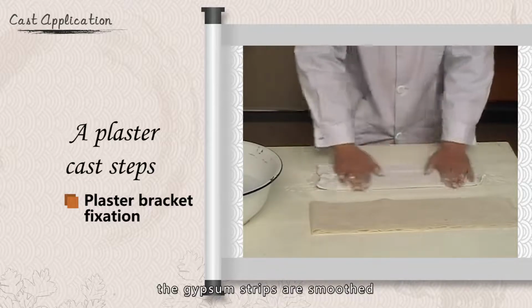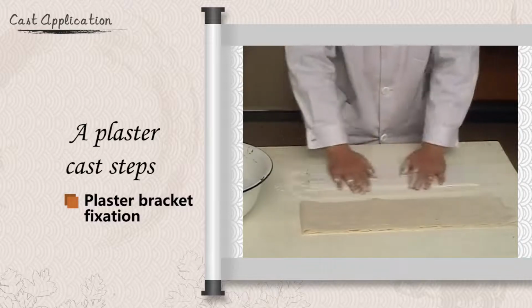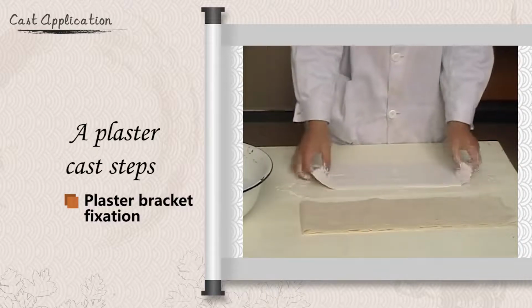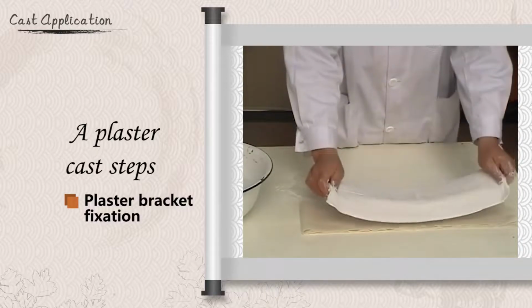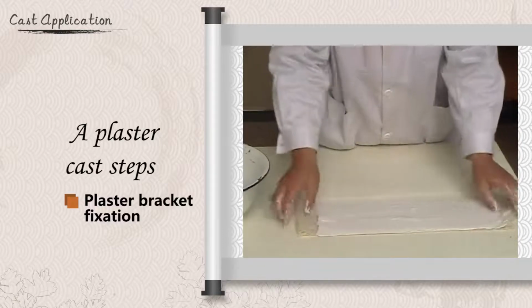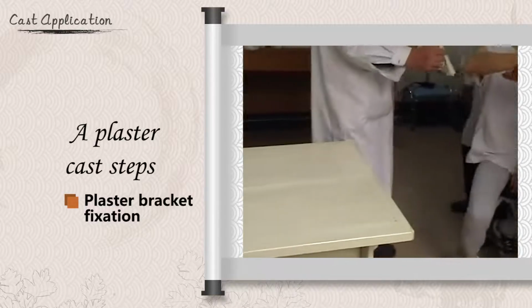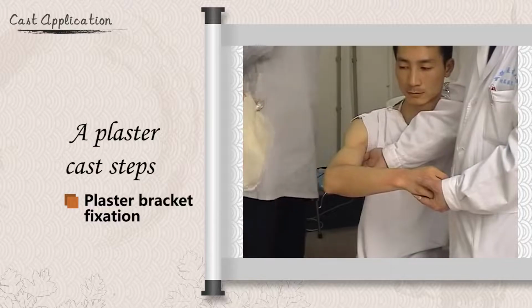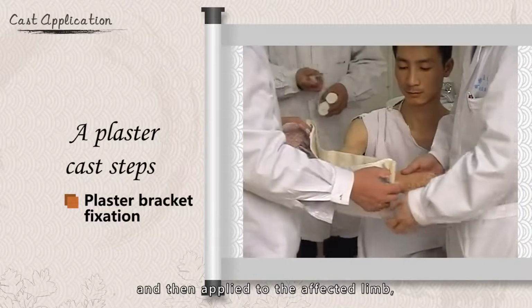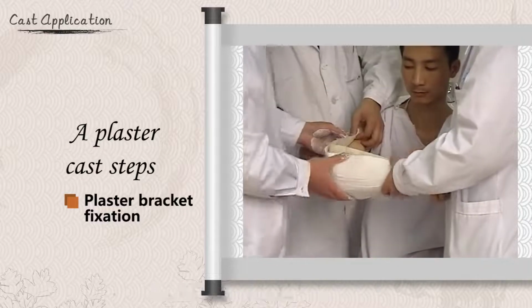The gypsum strips are smoothed, and then applied to the affected limb, and a bandage is wound and fixed.